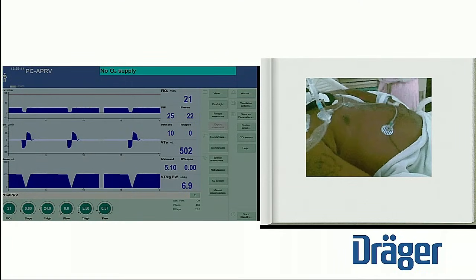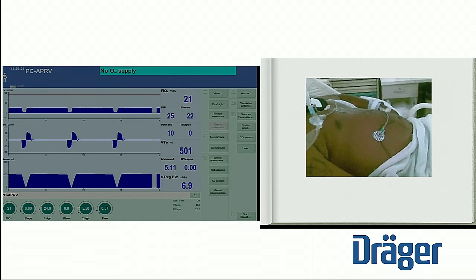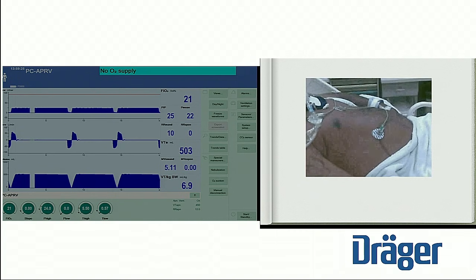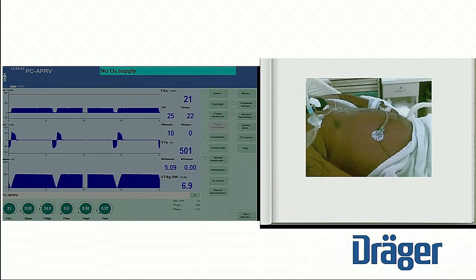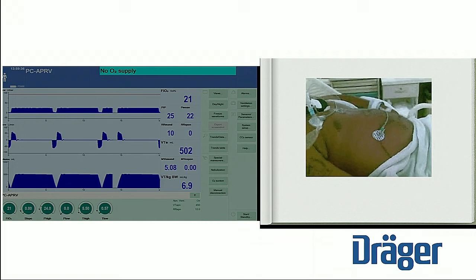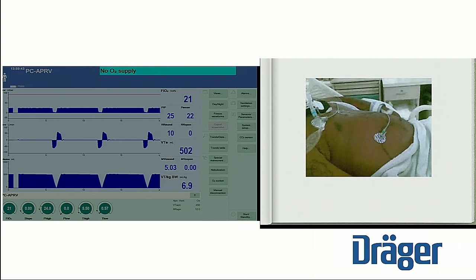This is a low tidal volume strategy patient. If you look carefully, the patient is actually pulling their airway pressure down — their PEEP level down — and they're actually developing a lot of pleural pressure to suck this pressure waveform down. So just because you're not on APRV, it doesn't mean you cannot breathe. In an adult patient with a rigid thorax, it's very unusual to have this happen unless you develop high pleural pressure — this patient's sternum is being sucked inward during inspiration. This type of dyssynchrony is really unfavorable and can generate huge pleural pressures, which aren't good for you.